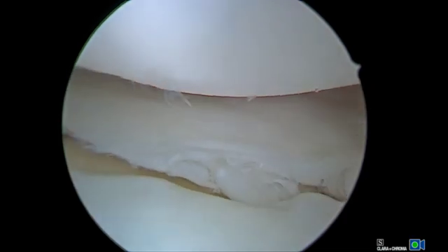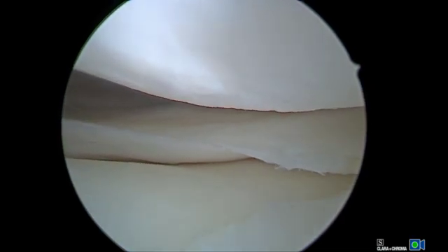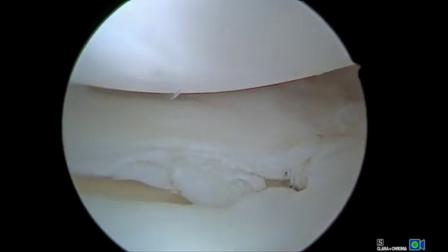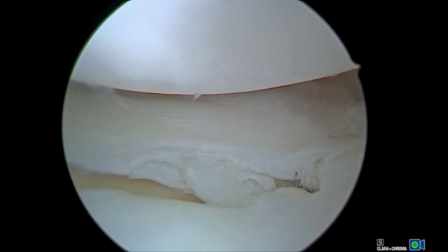Standard portals are made and a diagnostic arthroscopy is then performed. On inspection of the lateral compartment, a complex meniscus tear at the junction of the anterior and middle third is identified. Once the meniscus tear has been identified, a probe should be used to characterize the tear and determine if repair is feasible. Furthermore, the amount of gapping at the tear site should be assessed and reducibility should also be assessed using the grasper.